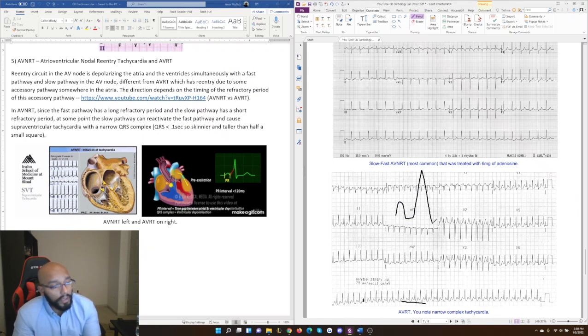Then you get your QRS, right? And then you get the T. So what you're seeing here is that the P wave went up, and then it was supposed to come down, but your QRS already started coming, which means that the QRS started here somewhere, right? And it's eating up some of the P wave's descent time. So that shortened this distance here that's known as the PR distance, which is supposed to be the amount of time you have for blood to go from the atria to the ventricles, okay? So that's what you're catching here.